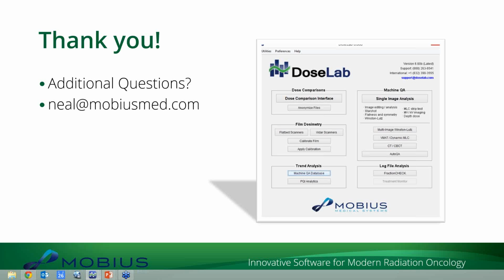Question came across, any applications used for IMRT planned versus measured film comparison? That would be in the DoseLab Pro version of the software, where you have the film dosimetry, and yes, that's all built into there. Film calibration, again, that's part of DoseLab Pro. I'm not going to cover that today. We can have another webinar that we cover some of the DoseLab Pro stuff, but I have to be honest with you, I'm not real good with the film dosimetry stuff yet, and so I don't even want to try and go in there at the moment.